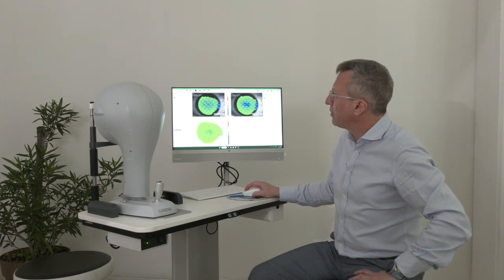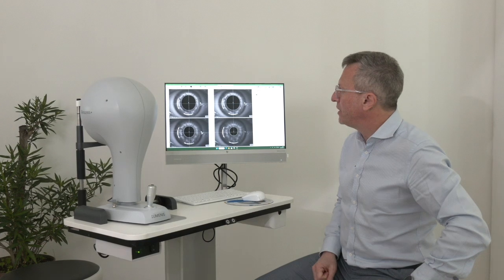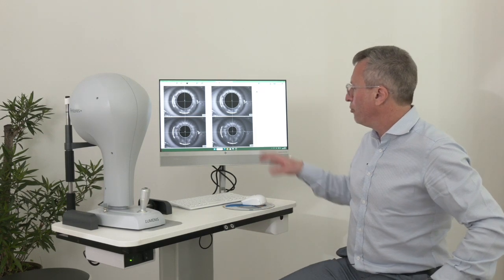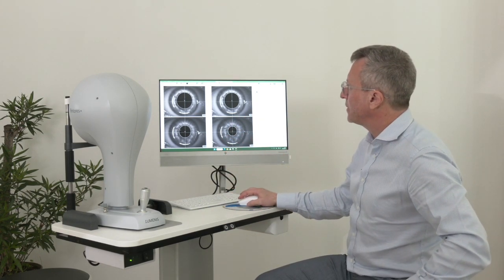If a pupillography has been acquired, you can select the pupillography immediately for the specific patient and see what happened in terms of pupillography compared to what you have just seen in terms of topography, aberrations and so on.